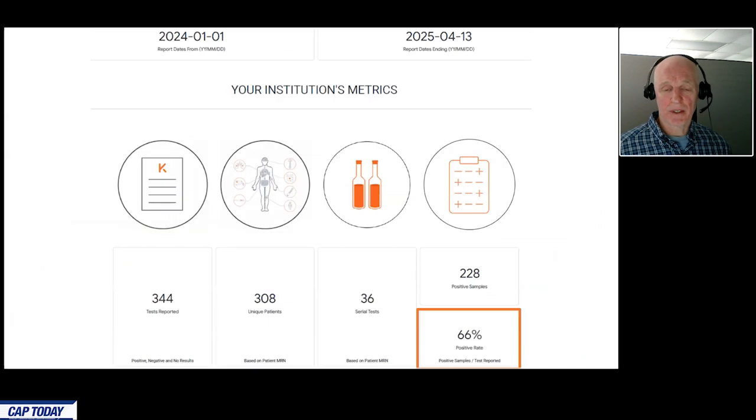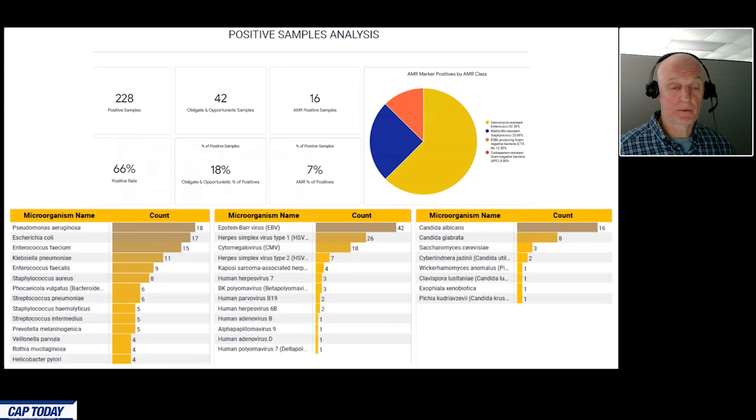This experience agrees with our experience. We have also found in the hands of our infectious disease providers that our Karius tests come back positive 2/3 of the time. Organisms most commonly reported are enteric gram negatives, E. coli, Klebsiella, and gram positives, both Enterococcus faecalis and faecium. The number one bacteria detected over this snapshot that we've been looking at, beginning Jan 1, 2024, is Pseudomonas aeruginosa. The top 6 viruses detected are all herpes viruses, all from the herpes family.